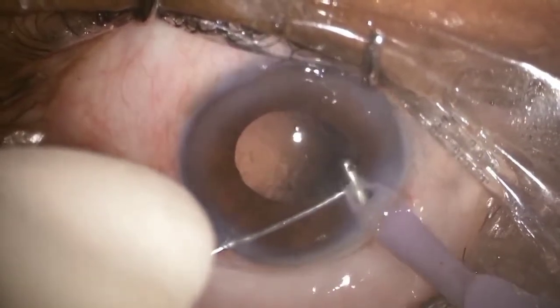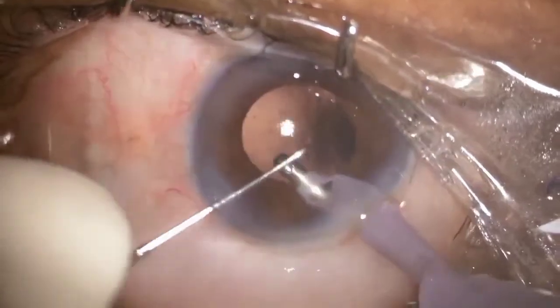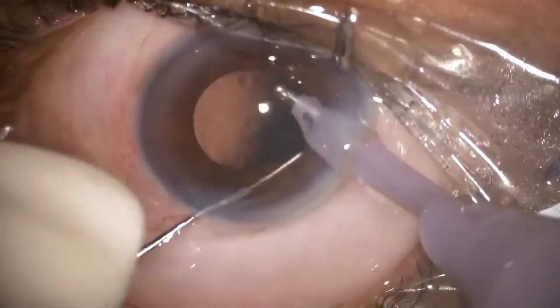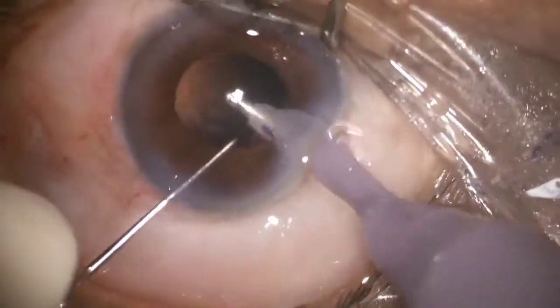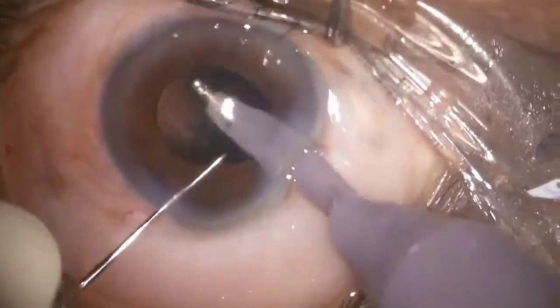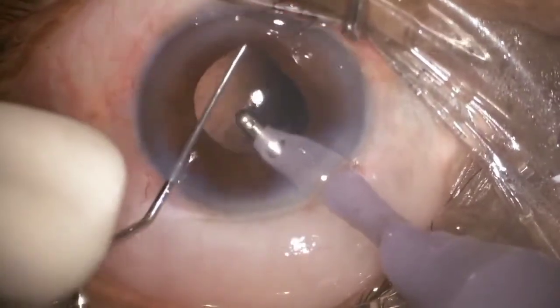So a few cortical materials were there, and very slowly I was doing the cortical aspiration. And then I noticed one small cortical material was there in the subincisional part. So I decided to remove it later. So I was doing polishing of the posterior capsule, followed by polishing under the rhexis margin.